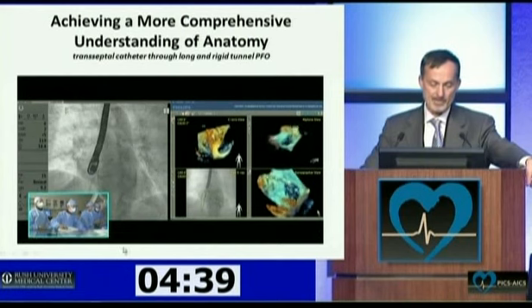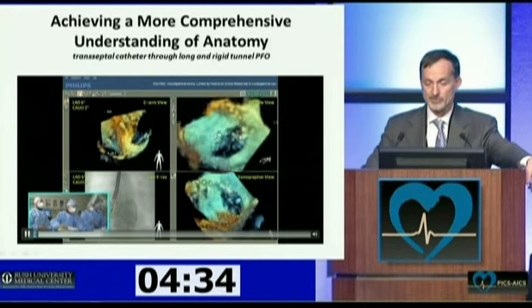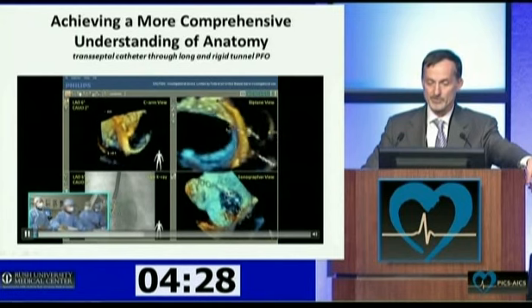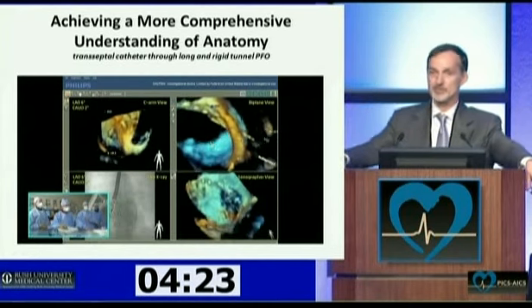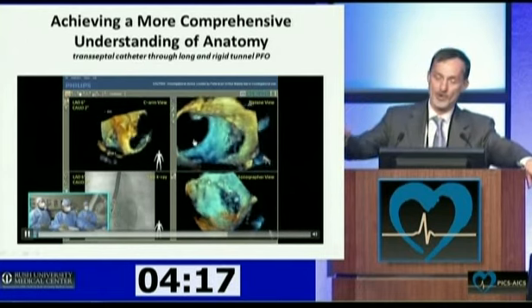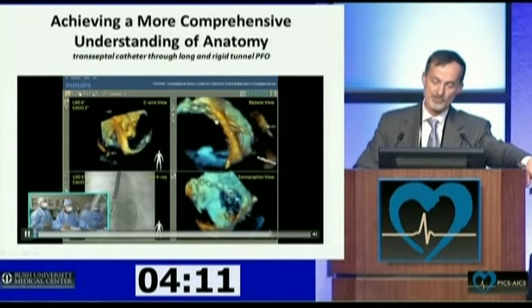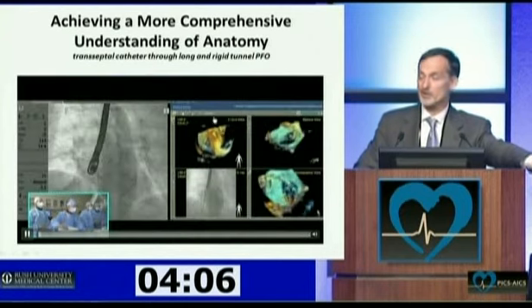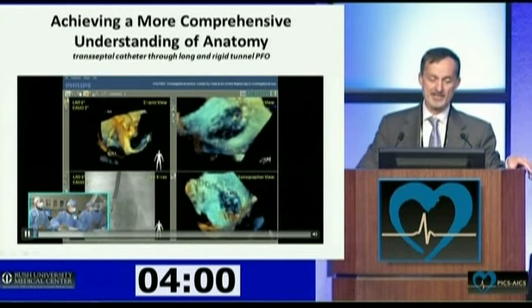Then on the table side, you have a mouse, so you can do a variety of different interactions with the image. You can move it, you can enlarge it, you can rotate it. So here's the intra-atrial septum, here's a transseptal catheter, and you realize now when you start interacting with these images, when we do procedures, we hardly cross in textbook fashion. We're often angulated. We're actually trapped inside a PFO tunnel with this transseptal catheter, something that I live to regret doing a mitral valvuloplasty where I couldn't maneuver. But you can see these images so well, and you can manipulate them at the table side.